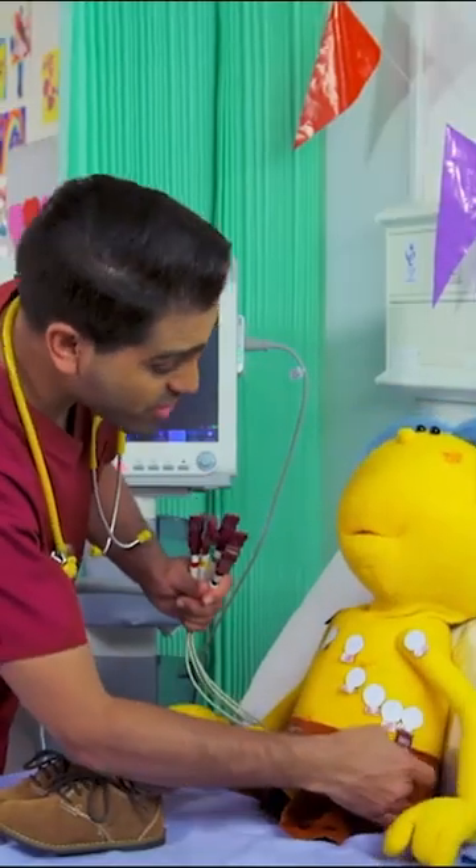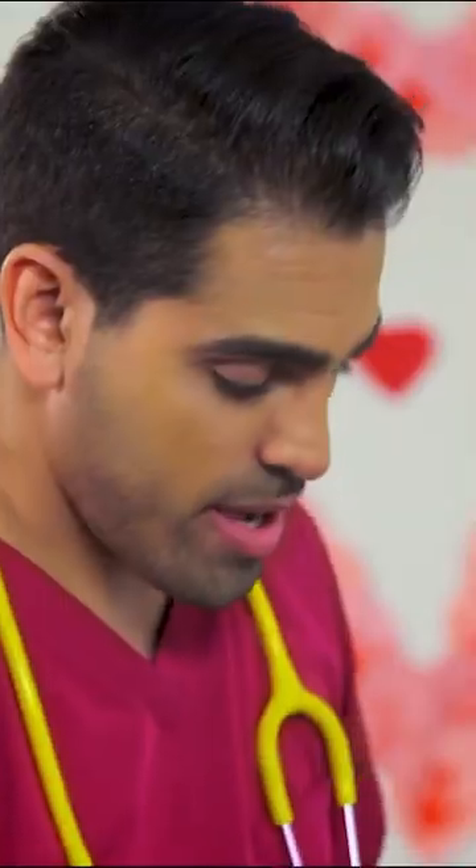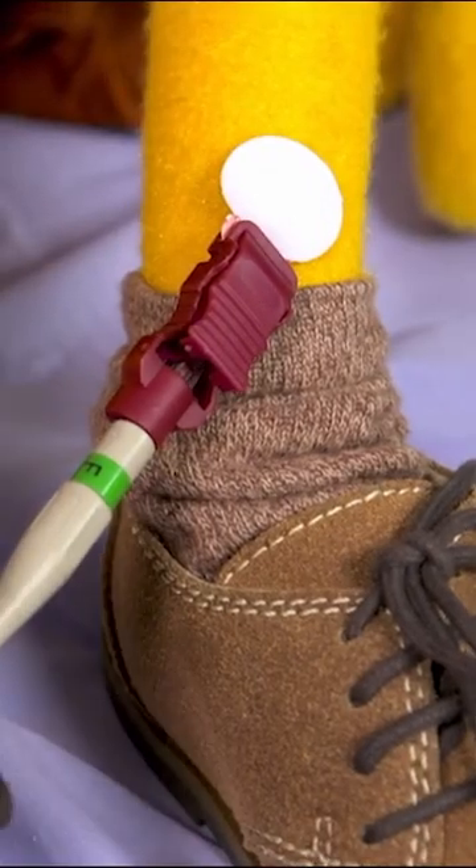We use this many sensors to check your heart from different angles. Why? Well, the special electricity that's in your heart flows in different directions. There we go. Last one. OK.